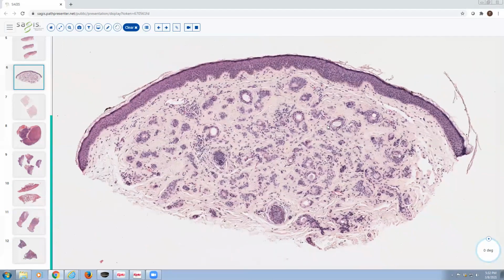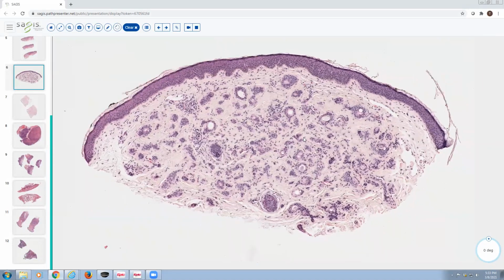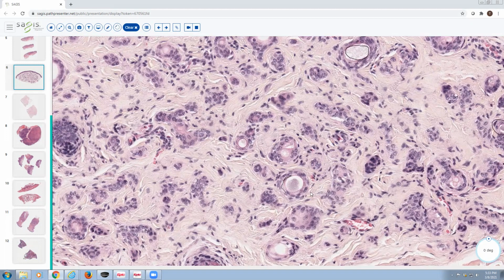So that is a syringoma, which is a benign neoplasm derived from the eccrine duct. The main differential here, I think, would be with your pilar neoplasms like Trichoepithelioma, Desmoplastic Trichoepithelioma. It can be very helpful to decide if you're dealing with a sweat gland neoplasm or a follicular neoplasm by looking at the contents of the little structures which have an empty space in them and deciding, is that a duct or is that a follicular cyst?